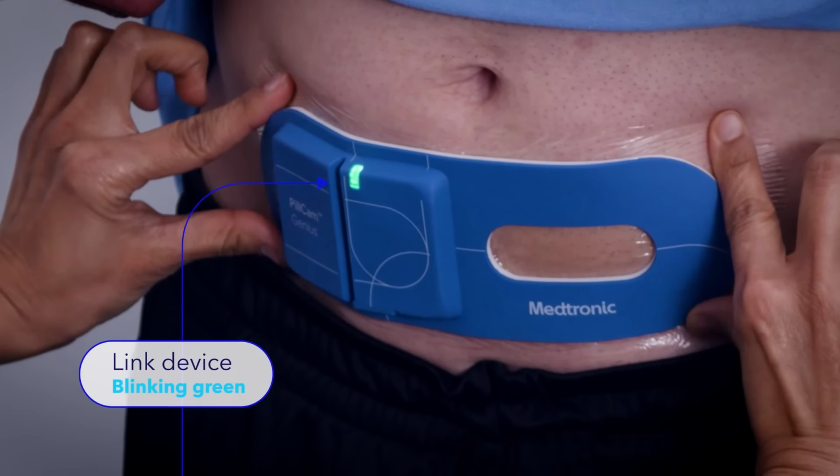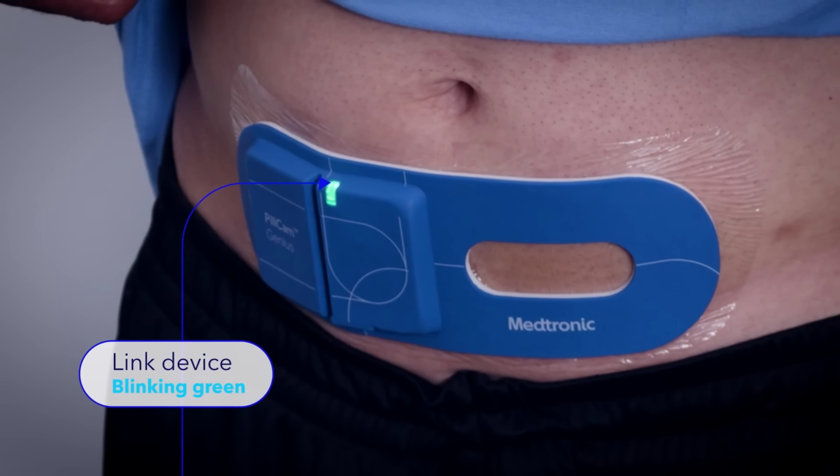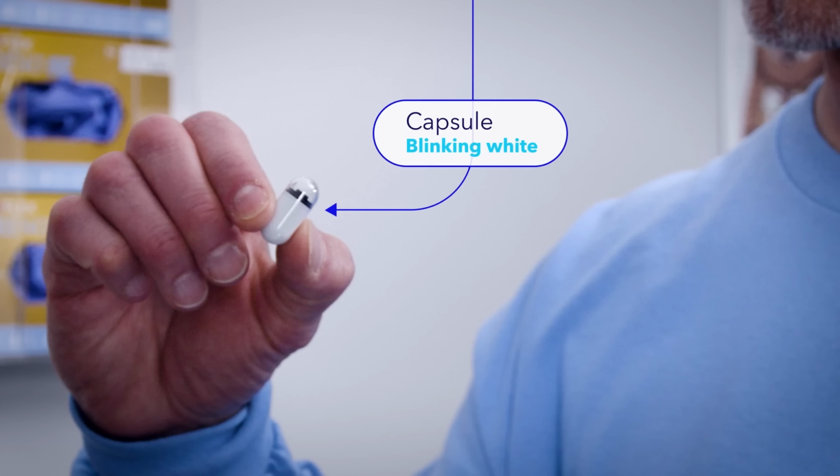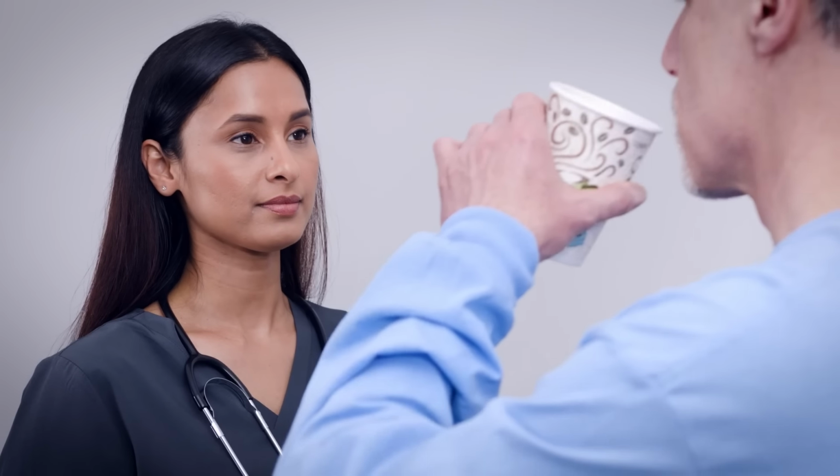Make sure that the PillCam Genius Link device on the patient's abdomen is blinking green, and the PillCam Genius capsule that the patient is holding is blinking white. Now, instruct the patient to swallow the PillCam Genius SB capsule with a sip of water.